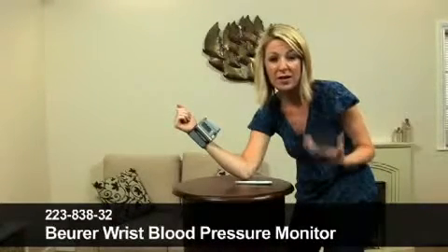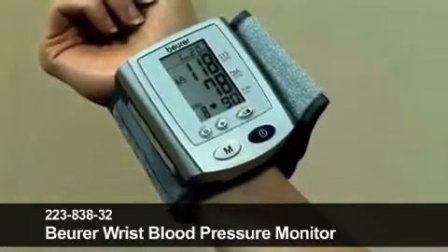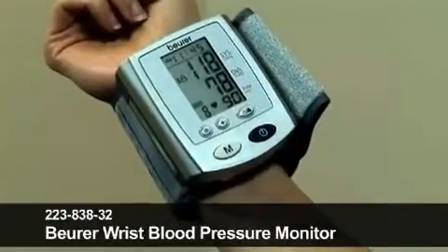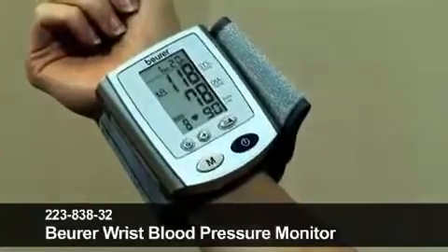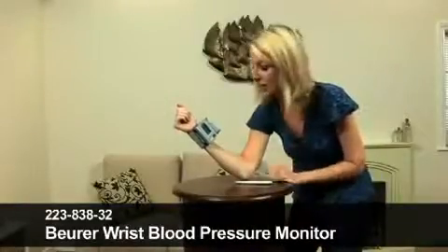As I say, many people have to do this on a daily or weekly basis for medical reasons, and this is perfect. It's finished, and it's telling me that my pulse is 90, and the two types of blood pressure: 118 over 78. I'm not sure if that's great or not — I feel quite relaxed at the moment, so I'm sure it's absolutely fine.